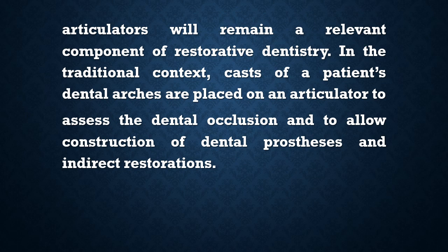Actually, in spite of all the advancement, we still need the traditional articulators, especially in developing countries and the Middle East. We need traditional articulators in order to make your dental prostheses, whether removable or fixed, and even a dental implant.